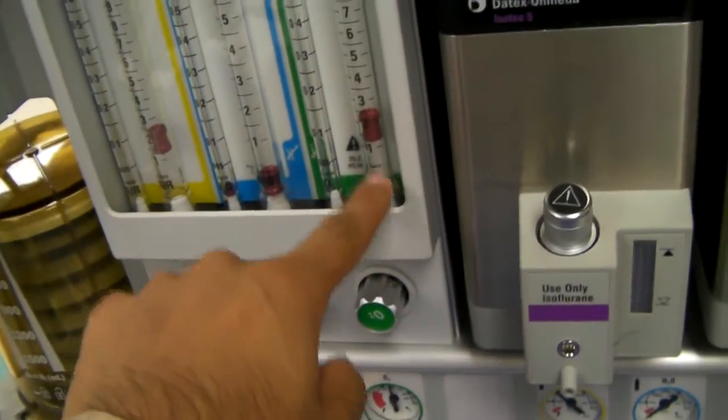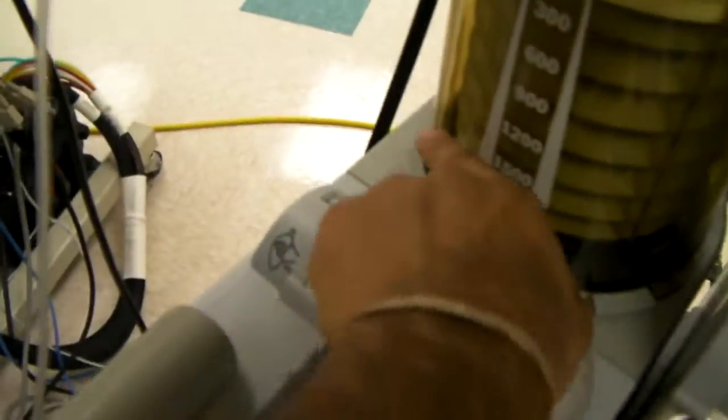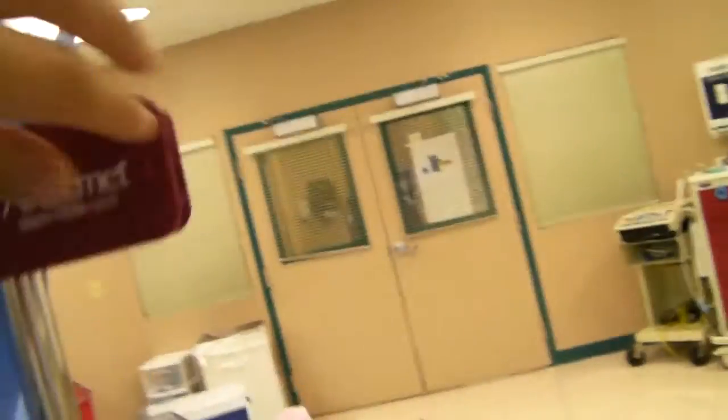He's currently on 2 liters of oxygen and 2 liters of air, which means he's breathing in 60% oxygen. This is the breathing bag. Sometimes if you want to breathe for him, you have to switch to bag mode, and then you can use this by squeezing it. I don't know if you can see right now, because I put up the drapes. Let me take the drapes down.